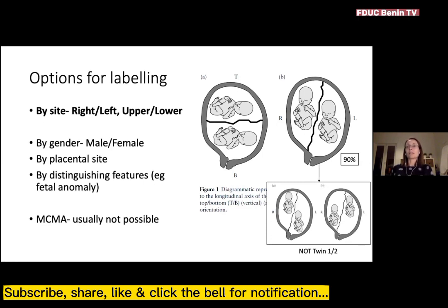And there are particular situations in which we need to know immediately after birth which twin is the at-risk twin. Say if there's a cardiac abnormality or something, some other abnormality, then we need to know which twin we're expecting to have that abnormality.